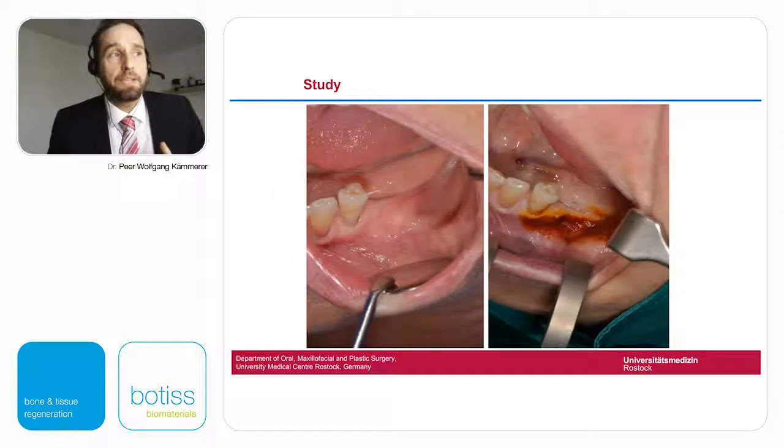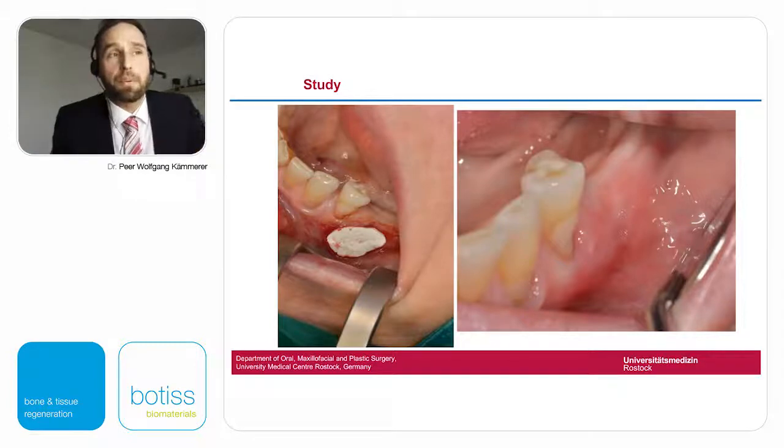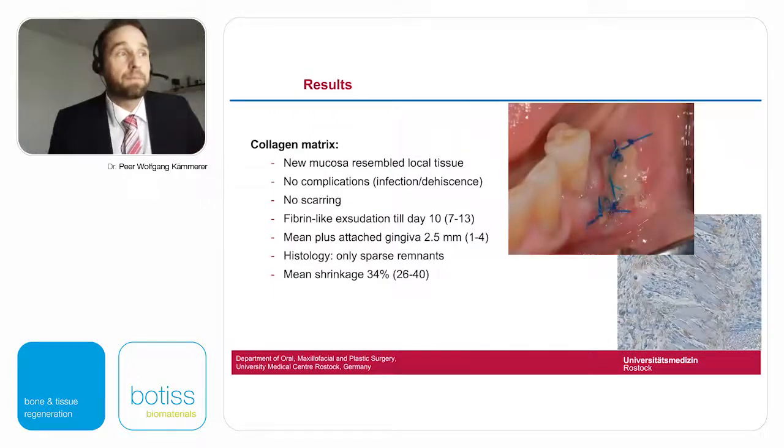In another patient, you see the same. We have the problems here. There's nearly no fixed mucosa there. It's all brown when using Lugol staining. Again, preparing of the bed, just short to show you some cases. And these are the results 3 months later. So you have a vast amount of new fixed mucosa for your implant, for your prosthesis.